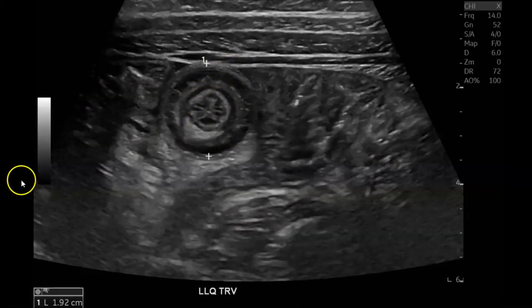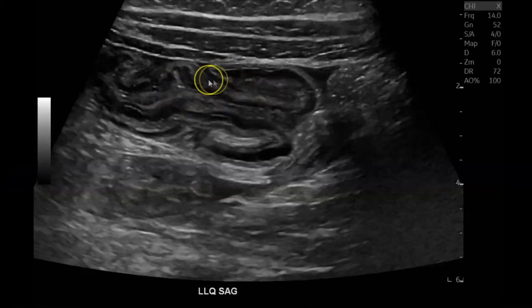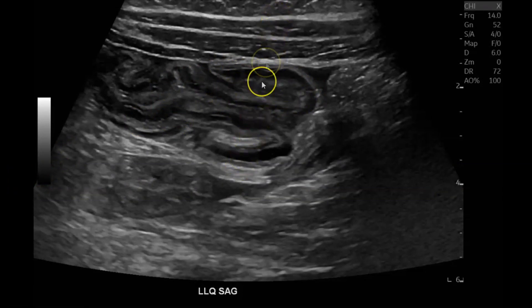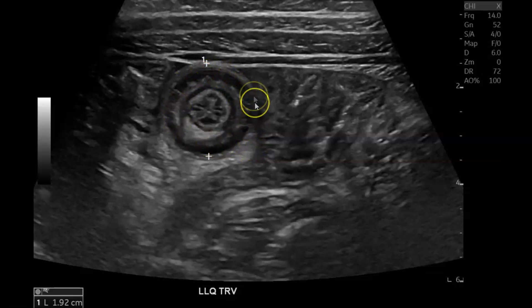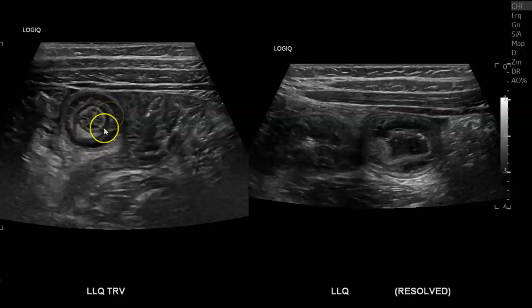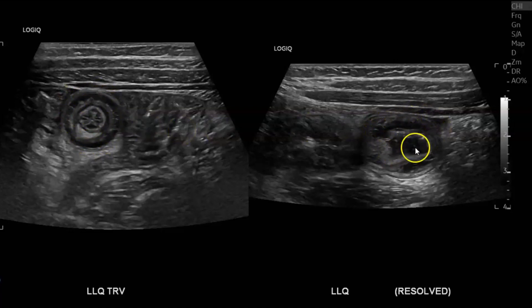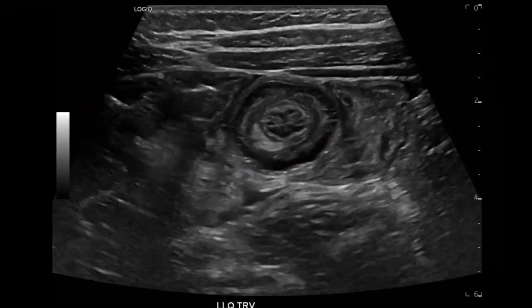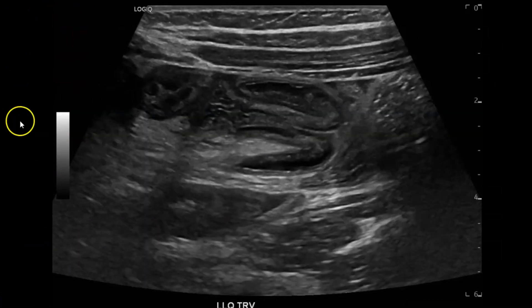You can see the one on the left in transverse, and then in sagittal you can see the intussusception going on right here. When you image this section in cross section it looks like a target lesion, or a donut — a bowel within bowel. Ultimately they both resolved. Here's the left lower quadrant small bowel intussusception, and here it is resolved. You can see there's fluid now within the lumen and there's no bowel within the lumen, though there's still some significant thickening of the bowel wall.